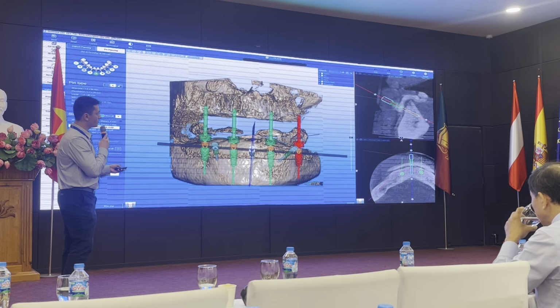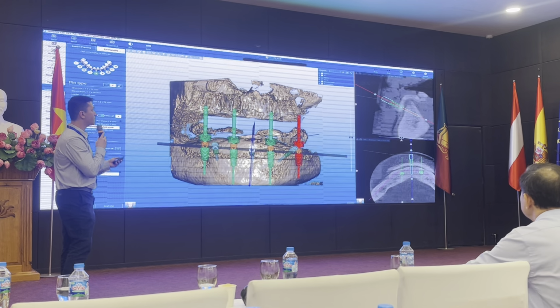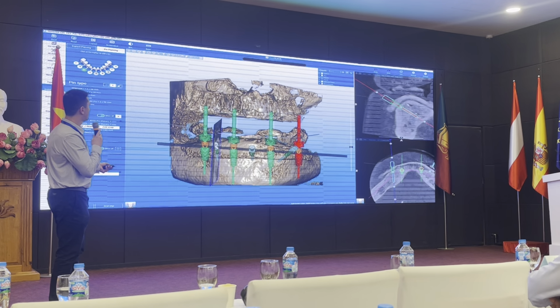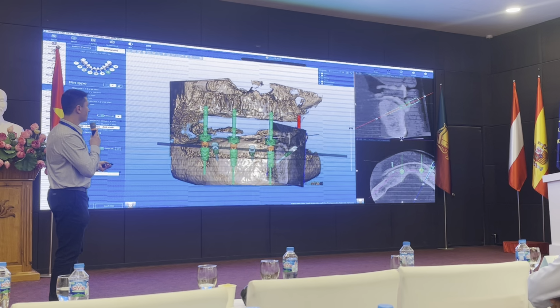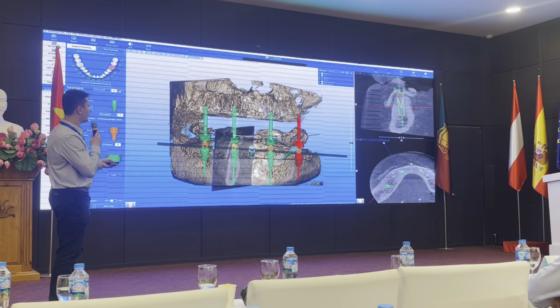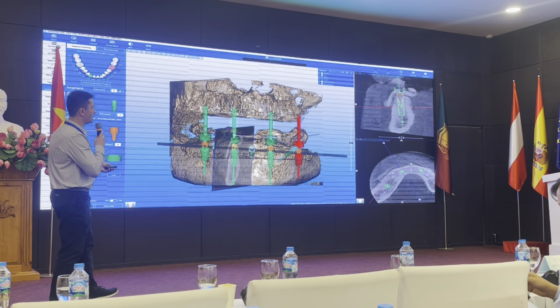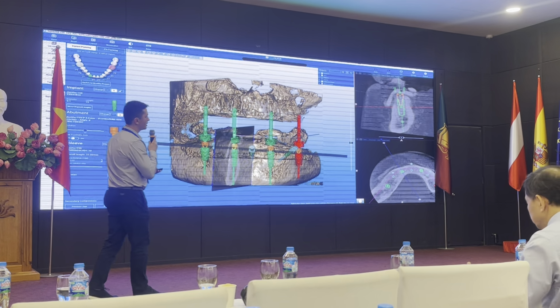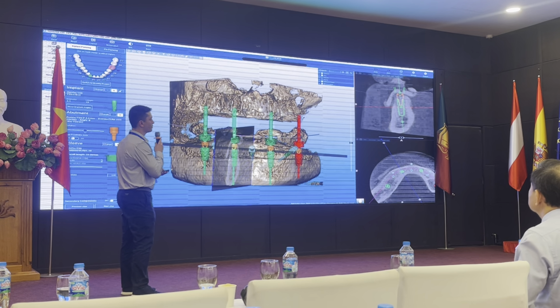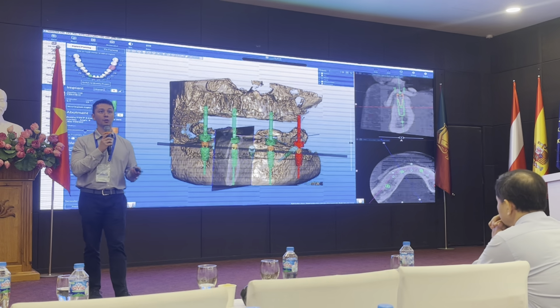So this is an anchor pin fixation, and these are going to be removed right after we finish the surgery. We position 3 of them, and you can see all 3 of them there. And then we plan our implant placements. RealGuide also lets us put the planned locator abutment, which is that connector to the implant that's going to help click into the future implant locator abutments.